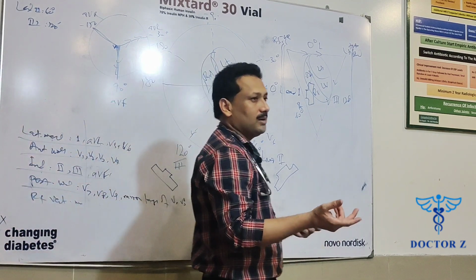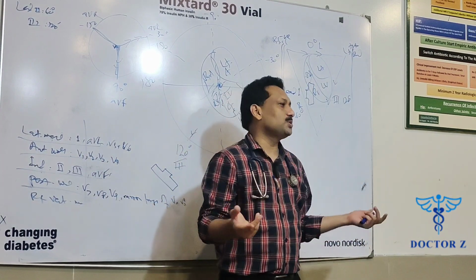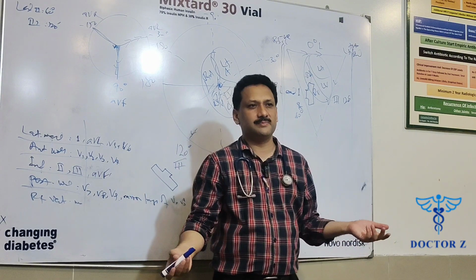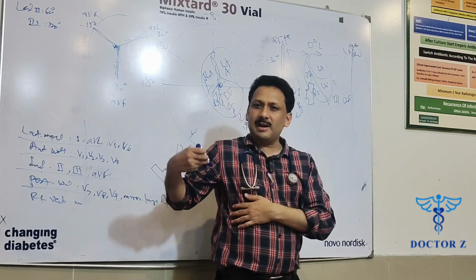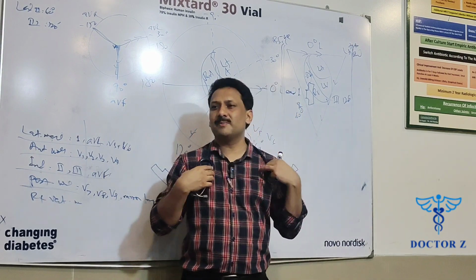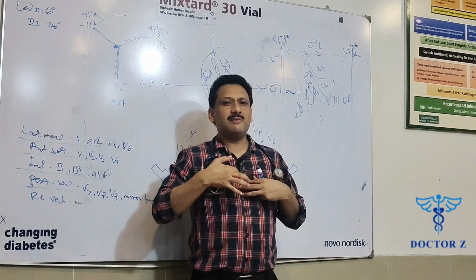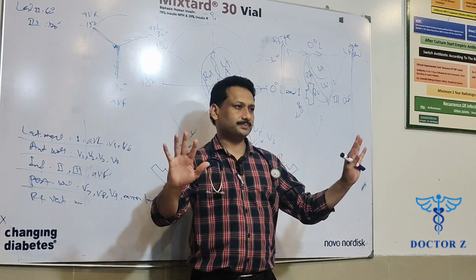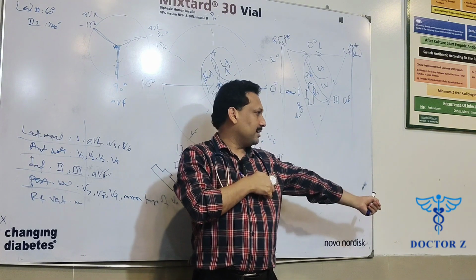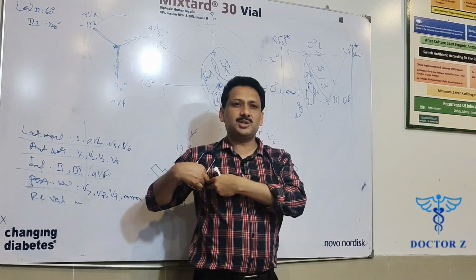Now the right ventricular wall, again, I have already told you about the camera thing. So where are we supposed to place our cameras, where are we supposed to place our leads? The answer is now towards the right side. First it was V1, V2, V3, V4. V1, V2 will remain as such. But instead of placing my cameras on the left side, now I will be placing them in exactly the same positions but on the right side.